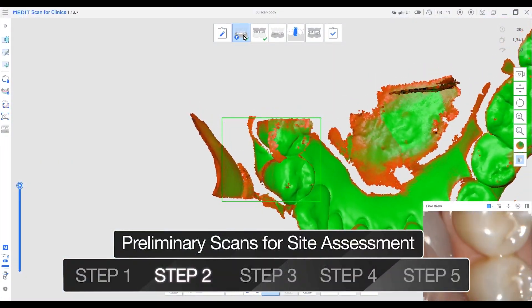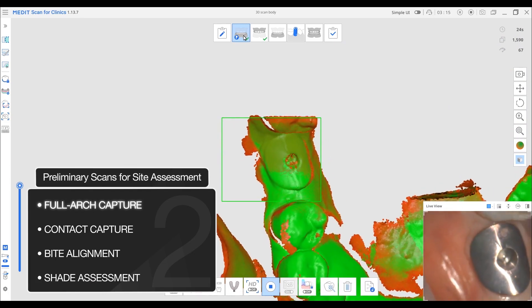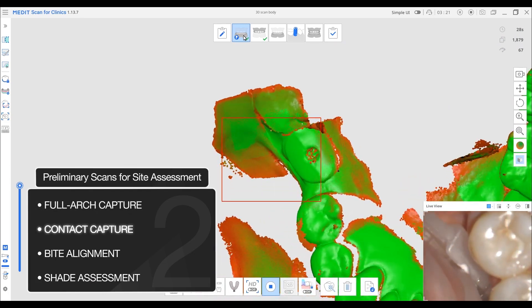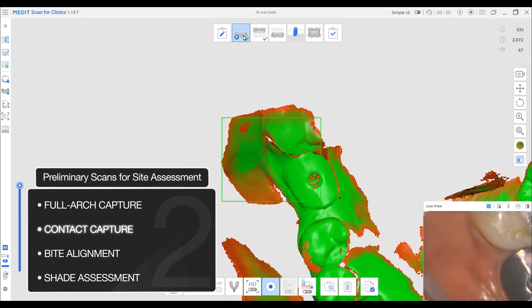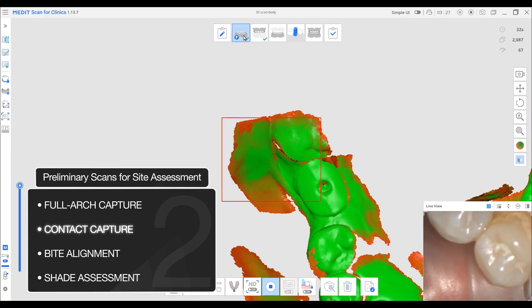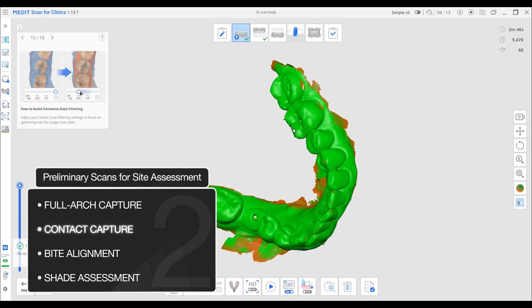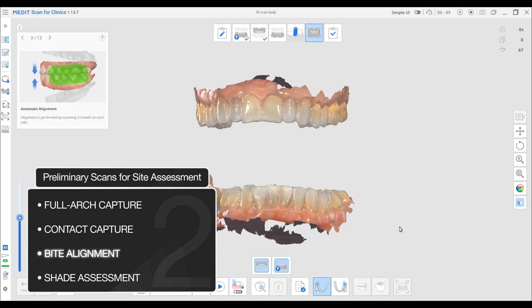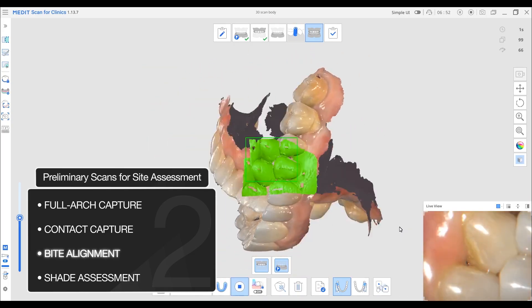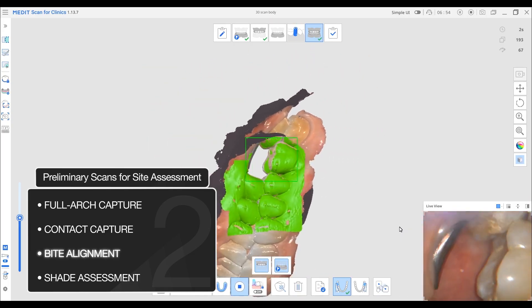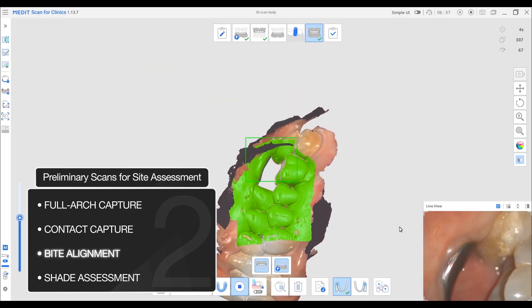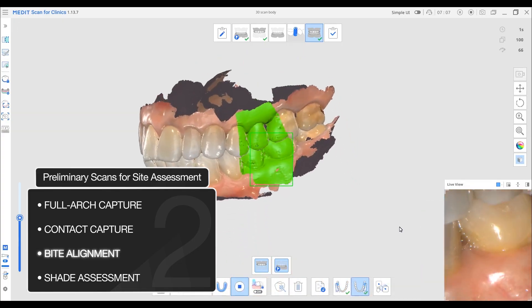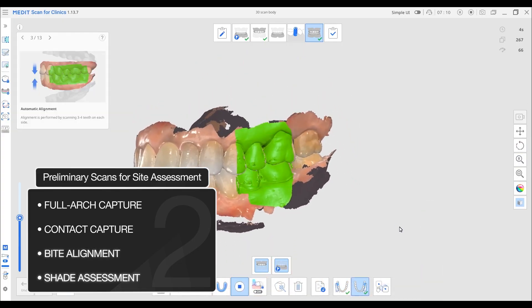I like to start both the upper and lower arches without the scan body in place. If you're capturing posterior contacts, you can leave the healing abutment in place to make interproximal contact capture easier. Then record the interocclusal record with the patient in maximum intercuspation. Capturing the bite before the scan body goes in prevents occlusal interference and yields a cleaner, more reliable bite alignment.